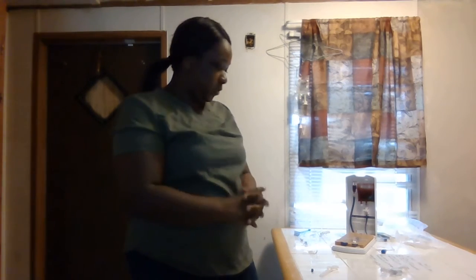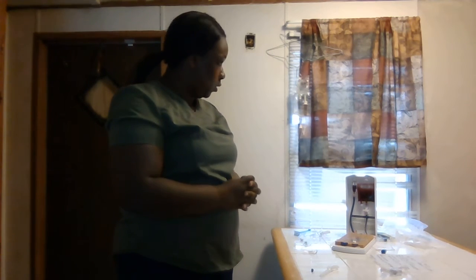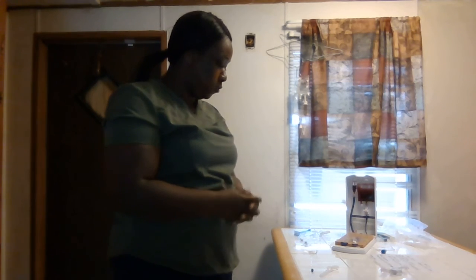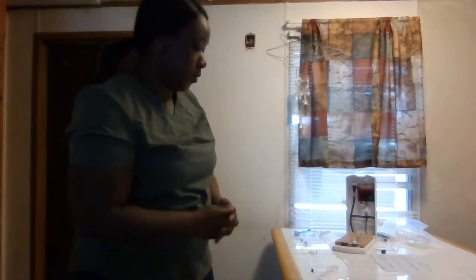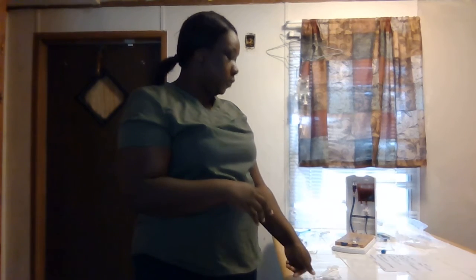Again, I'm going to just talk through it for time purposes. So to push the furosemide, I would have 2 3 ml syringes of normal saline so I can flush. I always remove air out of the syringes by pushing the plunger up.